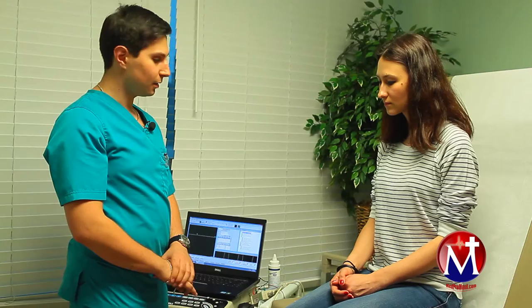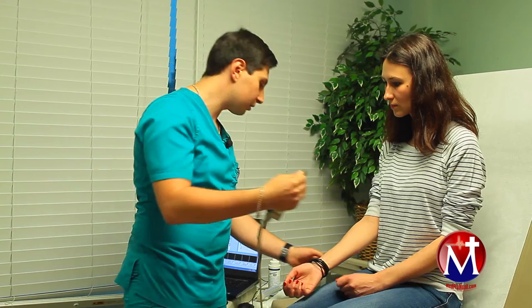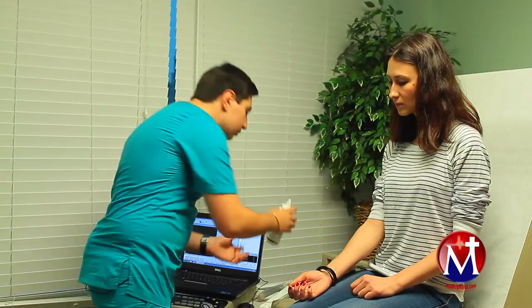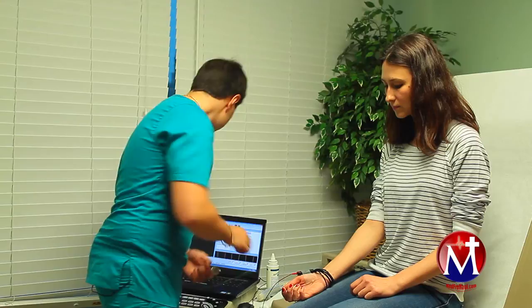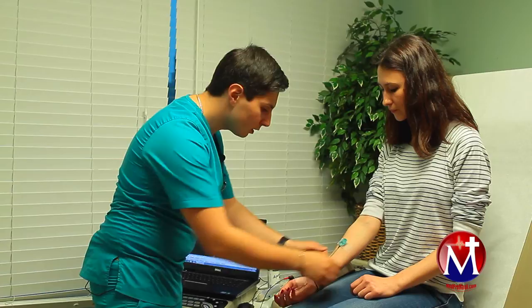I'm going to wipe off your skin with alcohol to make sure that there is no lotion which will cause impedance for the electrodes. Let me place this box on your pants. Now I'm going to stick some electrodes. I'm going to put some gel. Let me place it here. This one goes here. Let's move this bracelet a little bit away from the wrist.